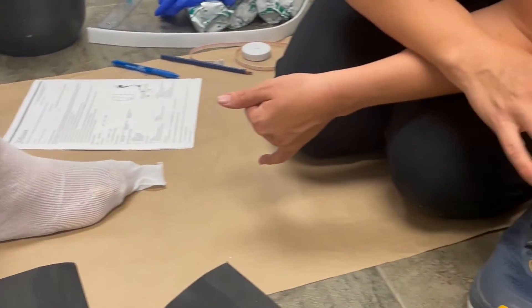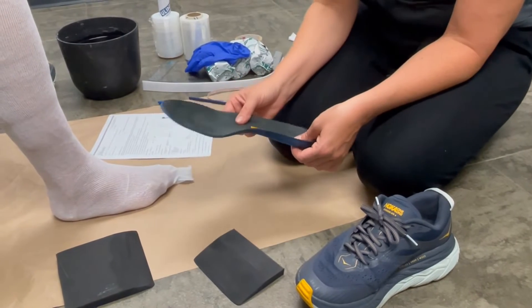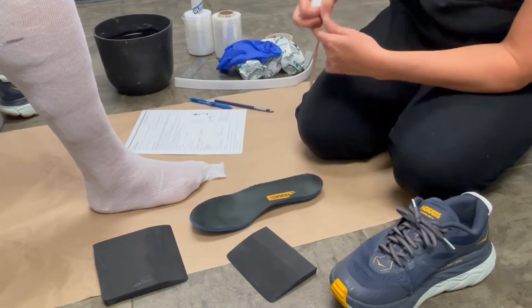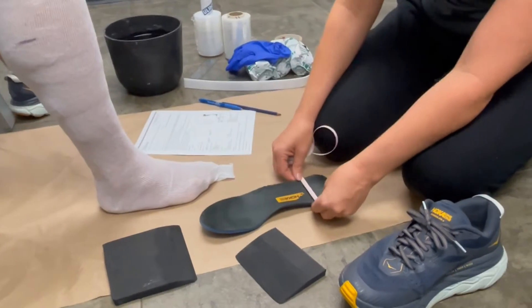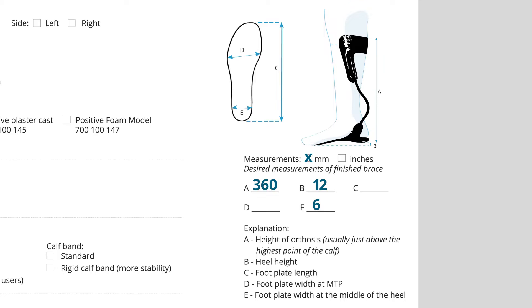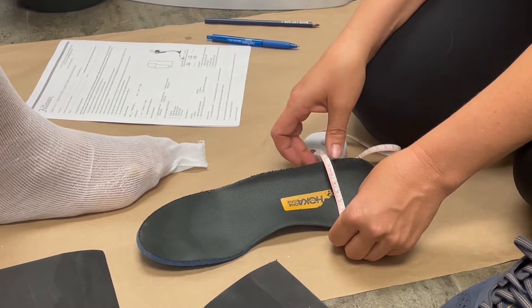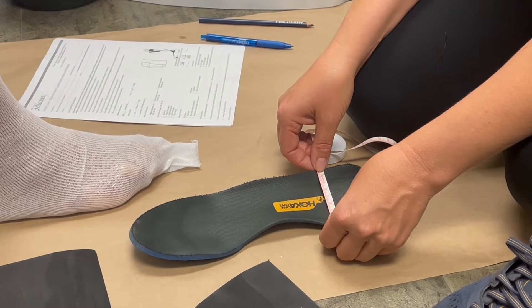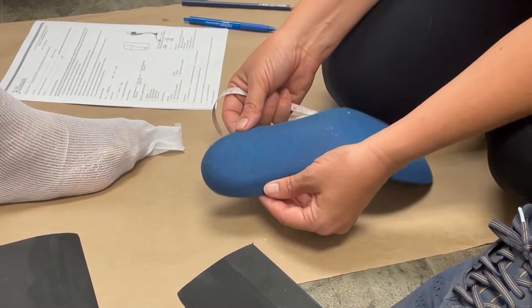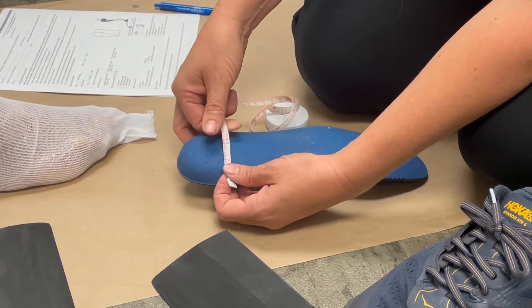To make the brace fit the shoe, it's important for us to know the measurements of the insole. You can trace the insole on a piece of paper or take measurements. For the heel width — the E measurement — I measure here and get 60 millimeters. You want to make sure you're getting the heel width that sits down inside the shoe, not the outside taper of the shoe insert.